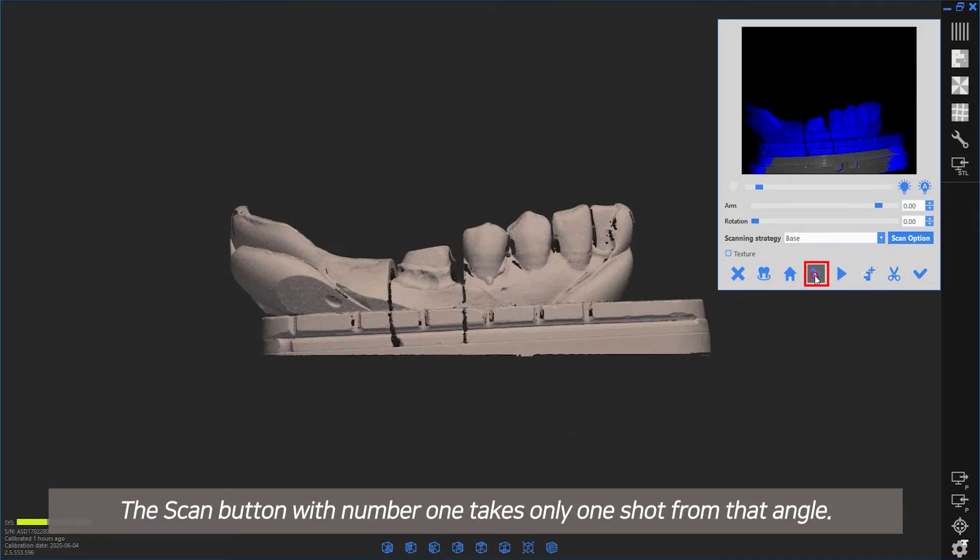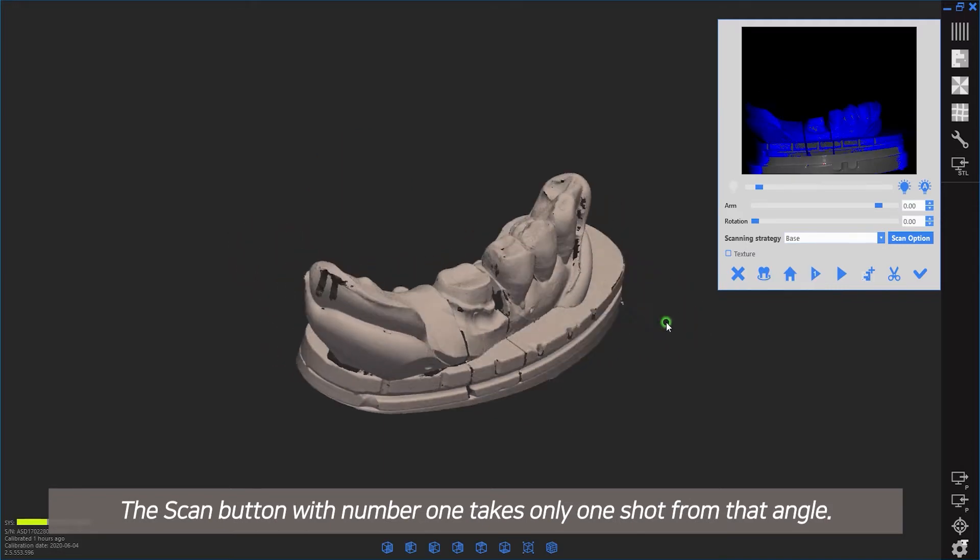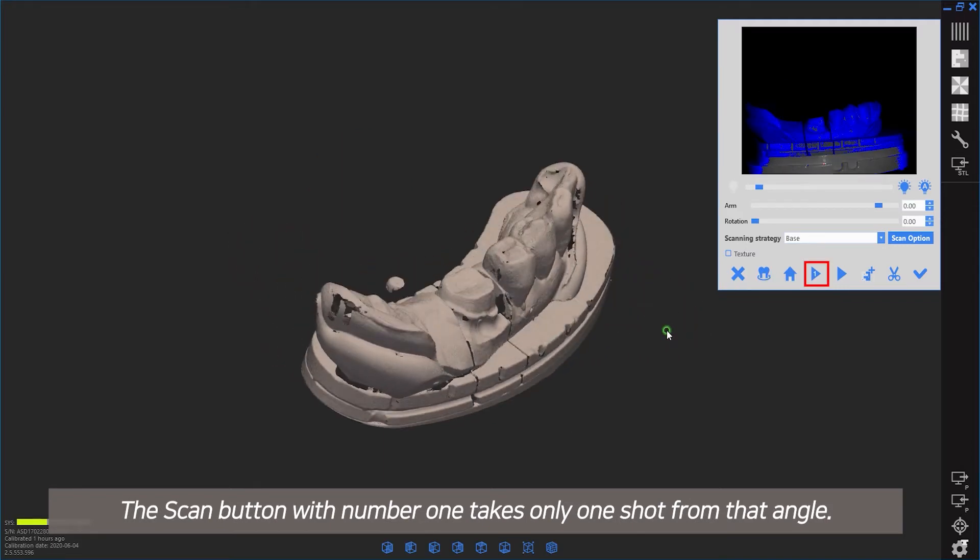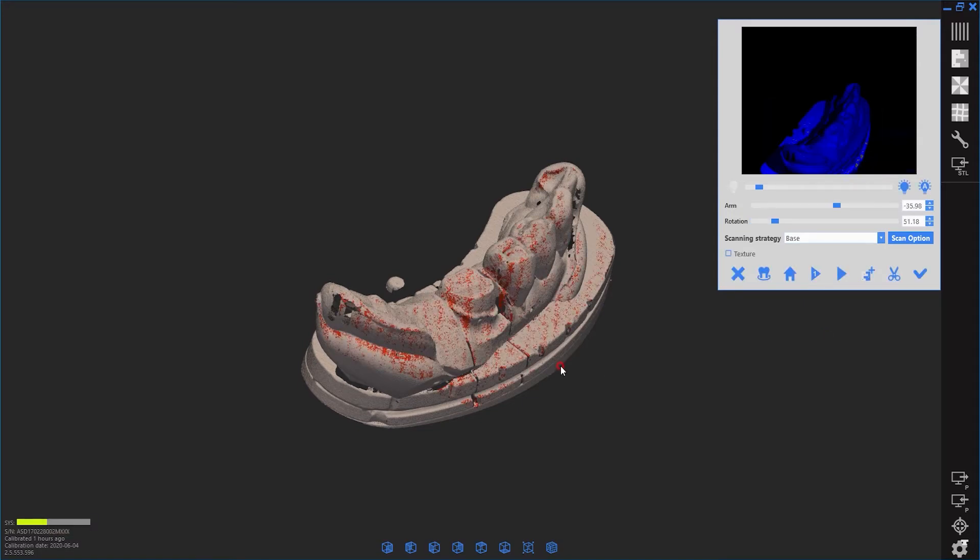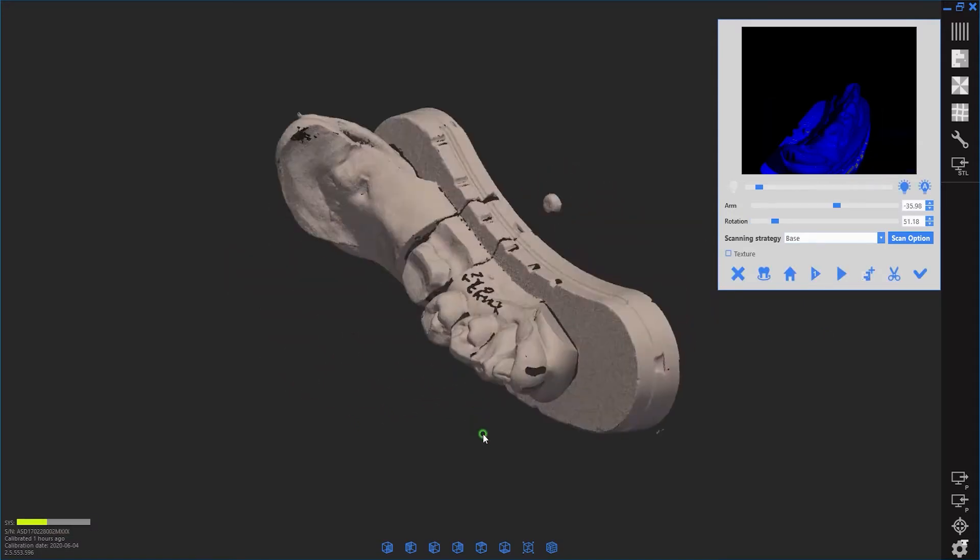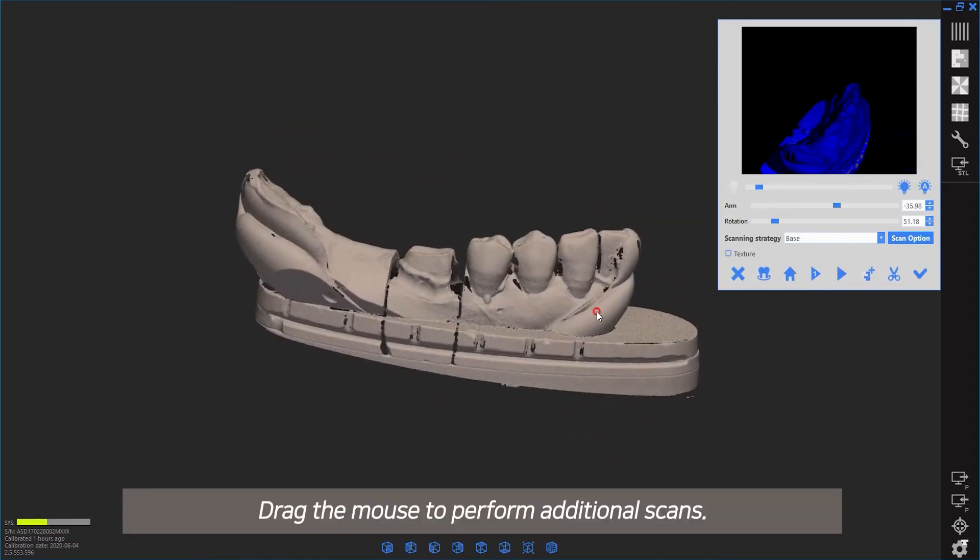The scan button with number one takes only one shot from that angle. Drag the mouse to perform additional scans.